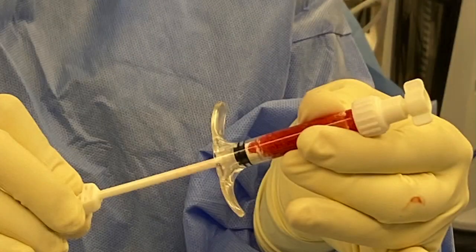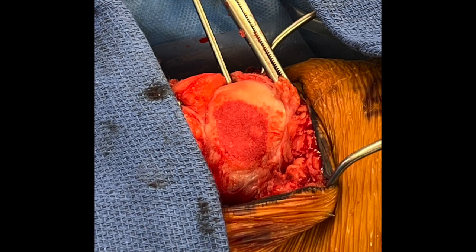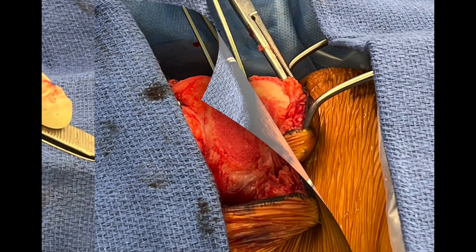The graft putty is then prepared using biocartilage allograft extracellular matrix along with the minced autograft cartilage and BMAC for the delivery of progenitor cells. This mixture is then placed within the base of the prepared defect and packed to a level where the graft height is recessed by one millimeter from the surrounding cartilage.